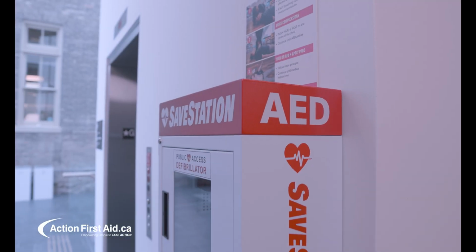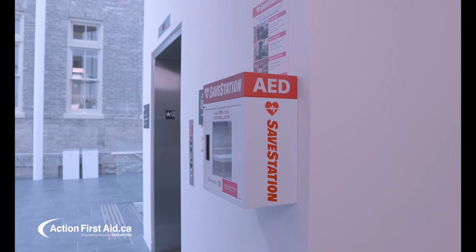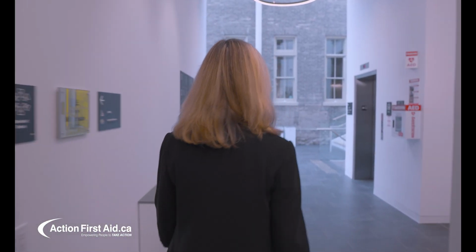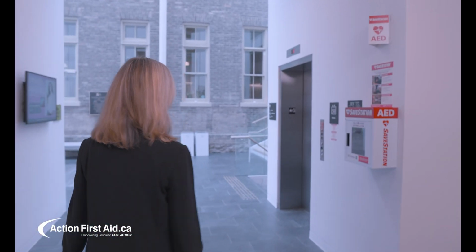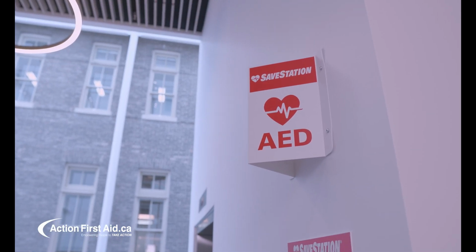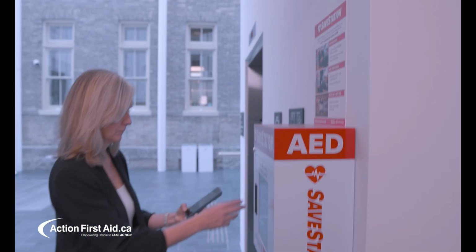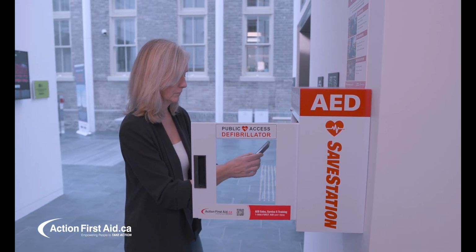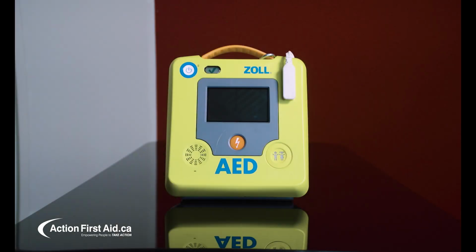Checking your AED once a month is easy and fast. At the beginning of every month, our system will send an email to the AED caretaker, letting them know it's time to check your AED. Most cabinets will be alarmed, so you should expect to hear an alarm go off. You may have access to a key to turn off the alarm for the purposes of checking the AED monthly.